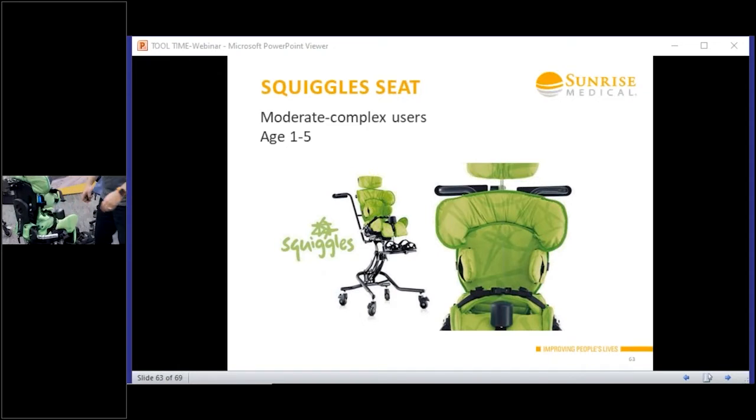We suggest if you're working with kids, anytime they're in a new size of clothes, so mum said, oh, she's just gone out and bought all these clothes, or dad's making a comment that all the pants are too short, then you really should be growing the chair or the stander. That's probably the key point. Parents are the worst to tell us when they've grown, but if you mention that they've just changed clothes size, that gives us a great indication.